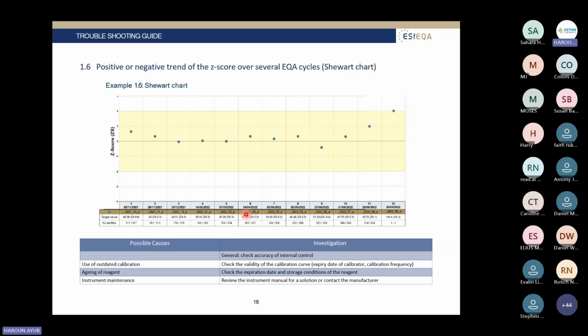Remember, those days are indicative, and some instruments will give you alerts where the calibration is off. So if you ignore that, it's on you now. But you'll find that all reagents will have those particular alerts, have them uploaded on your machine so that it alerts you when the deterioration is happening. Because that's the study that the manufacturer has done over time.